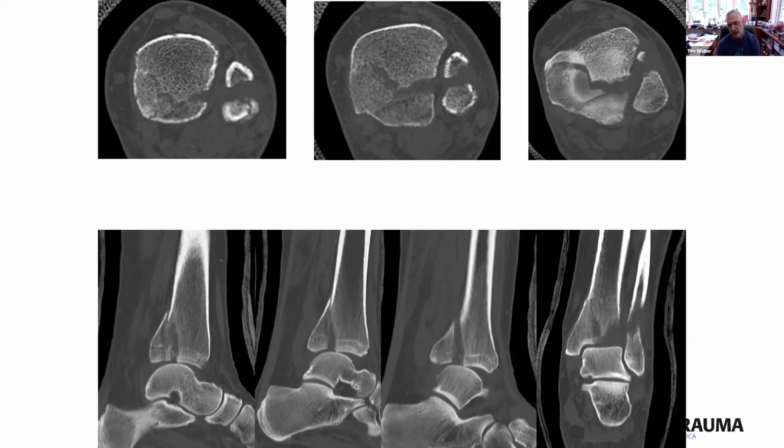And, you know, patients in the operating room, putting a lot of distraction on and then trying to go and do something else, work somewhere else. I also like using a lamina spreader, sort of a poor man's distractor. I'll put a 062 K wire in the fragment itself and, with the lamina spreader and a couple Kochers onto the K wire and the foot of the lamina spreader, be able to distract, not necessarily in the fracture site, but just trying to gain length that way.